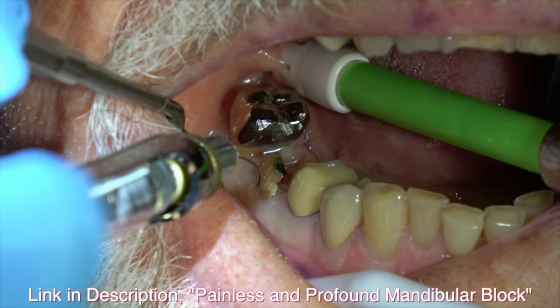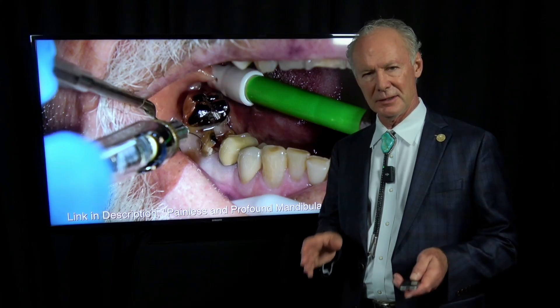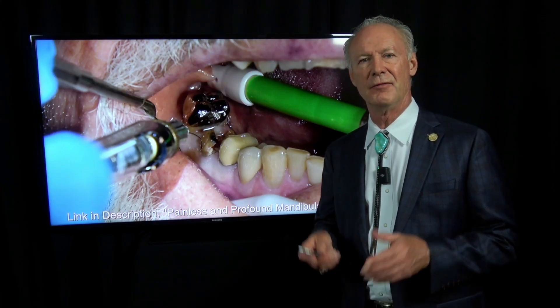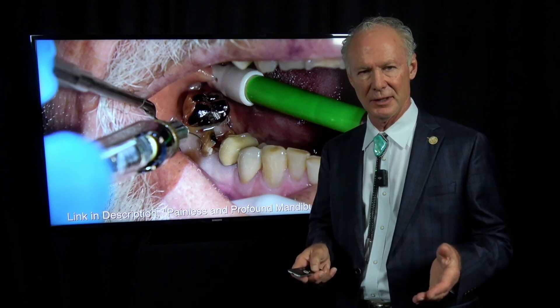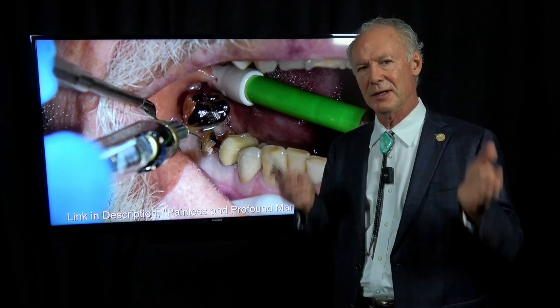Painless and profound local anesthesia is so key. I see so many patients who say their dentist could never get them numb, and they gave 10 injections. Please listen: it's not a volume thing, it's a technique thing. If you're doing endo on a tooth or if you're extracting a tooth, you have to give an intraligamental injection along with the mandibular block or the maxillary infiltration. If you don't give the intraligamental injection, the tooth has a very high probability of not being completely anesthetized.